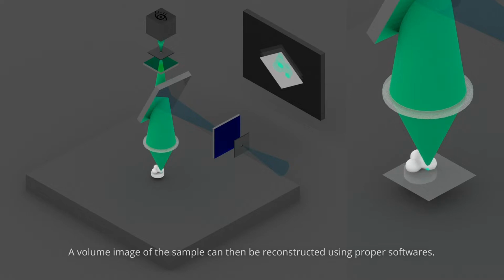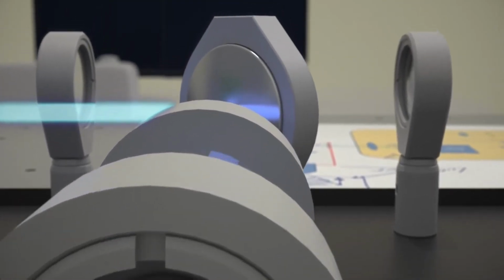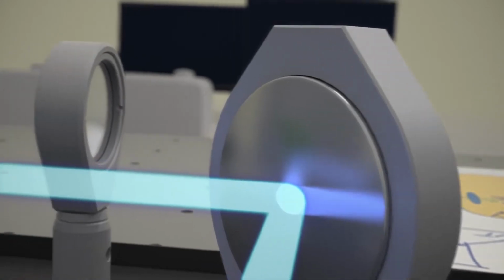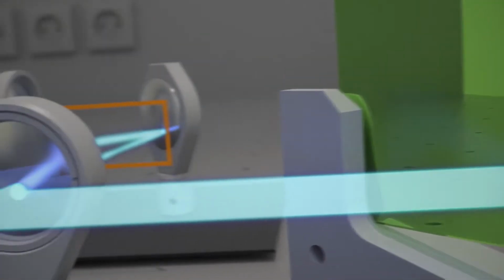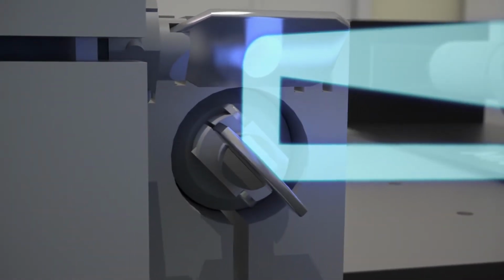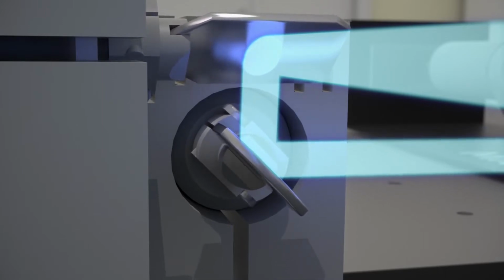1. The focus of reflected light should be sensitively collected on the sensor chip. The QE value of the sensor chip should be high enough and the response speed should be sufficient. Simple understanding is very sensitive to light. The higher the QE value, the faster the response speed, and the higher the price. 2. A strong enough light source is required. Trios uses LED light source, which requires Trios' light source to be bright enough and heat dissipation system to be excellent enough. 3. MEMS galvanometer system.